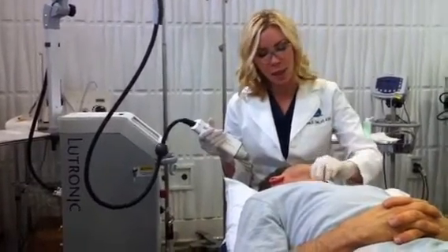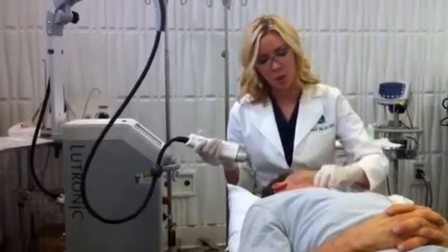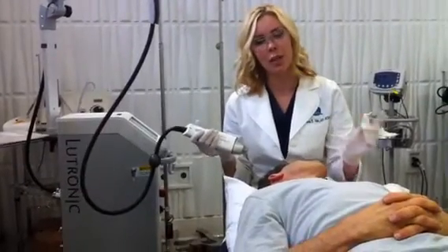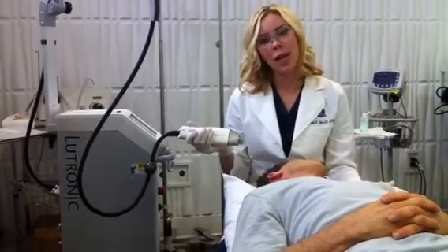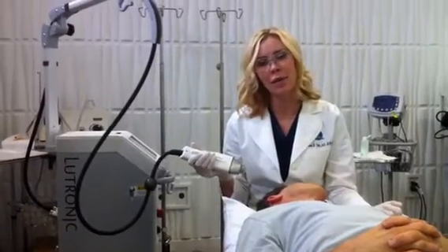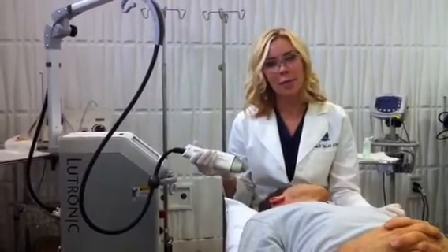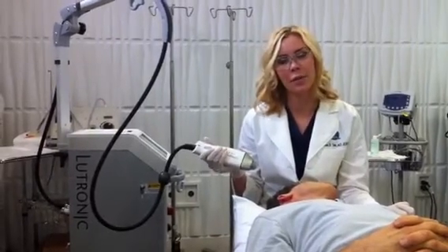It's really quite straightforward. The patient's had some topical numbing on, and we'll just sort of speed on through in a little pattern. I've actually treated the left side of his neck. It causes a little bit of redness, which lasts for about a day or so, and the skin can feel a little bit sandpapery, but other than that, there's not much downtime really at all. Patients can use just sort of a mattifying sunscreen for a day or so.